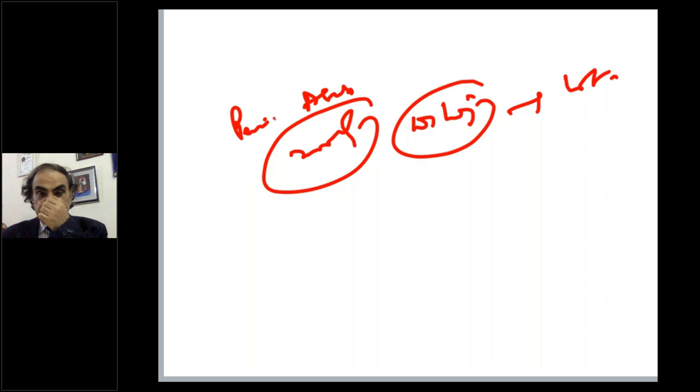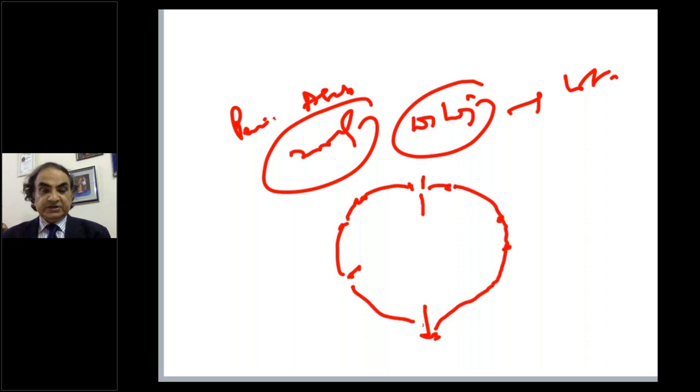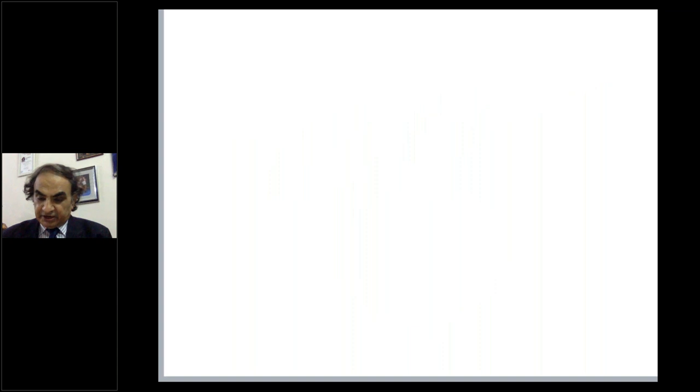By and large, this would be the diagnostic laparoscopy, starting with the cecum, ascending colon, hepatic flexure, right lobe of liver coming out, going beyond the falciform ligament, left lobe of liver, spleen, left splenic flexure, descending colon, sigmoid colon, and then we go down into the pelvis. That's the circle we usually follow. Now, I think with that we can conclude, and if there are any questions, I'll be happy to take them.